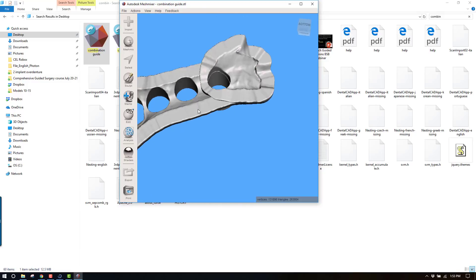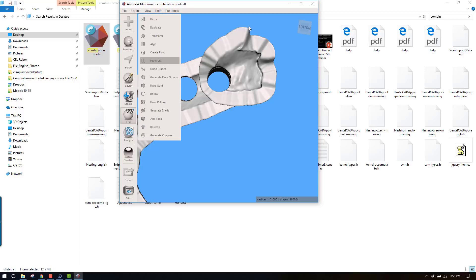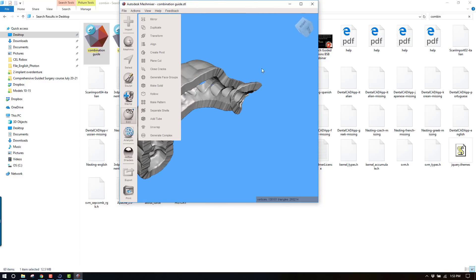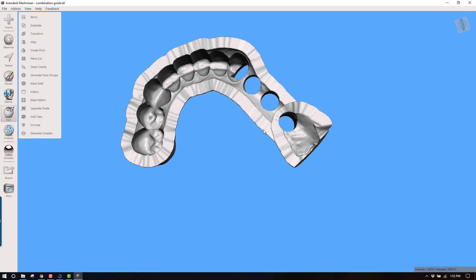There's a slight bug in the software right now that we're in the process of correcting, where it's building an excessive ledge right here. I can correct that very simply by just cutting that off. Now we have a guide that's ready to go — tooth and soft tissue supported everywhere up front, and a small bone portion right here that's going to support this in the posterior and ensure that we've got a hard tissue stop, so the guide is not going to deviate or squish in the tissue when we're drilling.